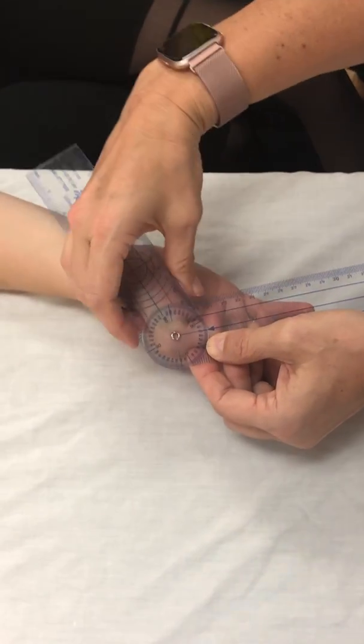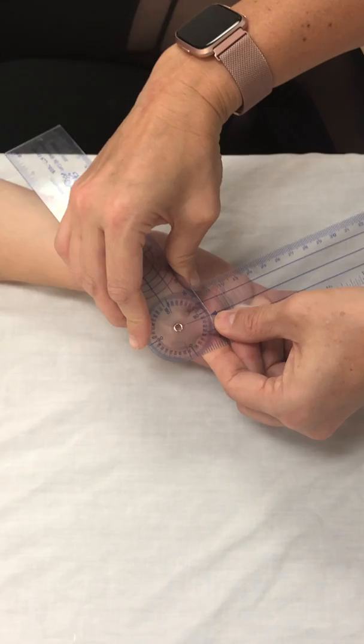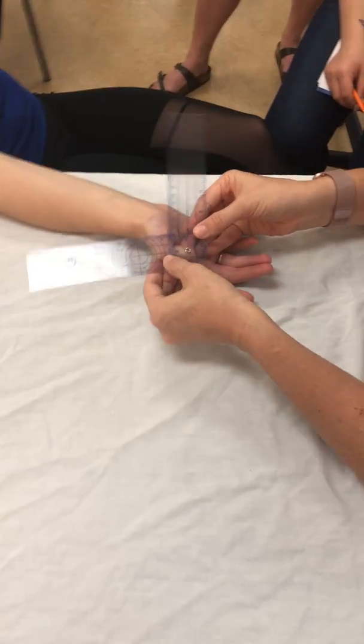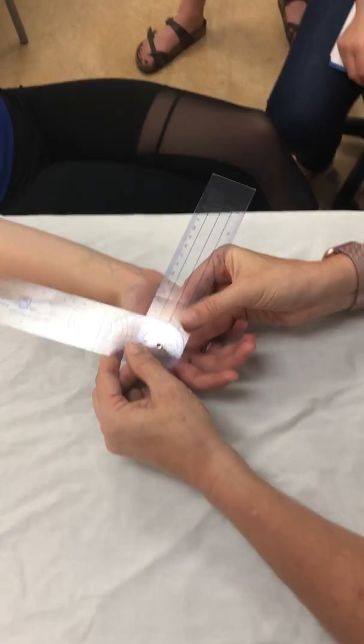And we're going to just follow that over. Man, that glare is crazy. Okay. And then if we wanted to measure IP, we would just come and move it down to the very next joint.